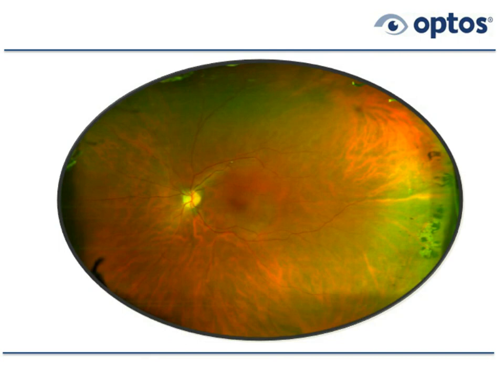Here's her left eye. Again, the disc and macula look okay. We go out all the way temporally. We can clearly see a lesion, which looks very much like paving stone. Maybe it is paving stone.